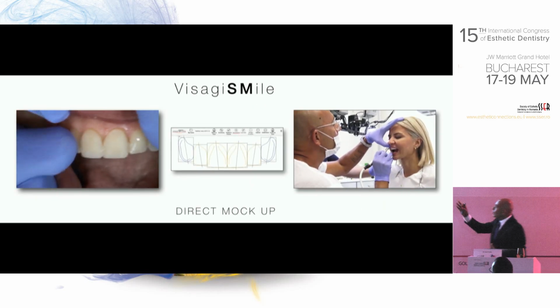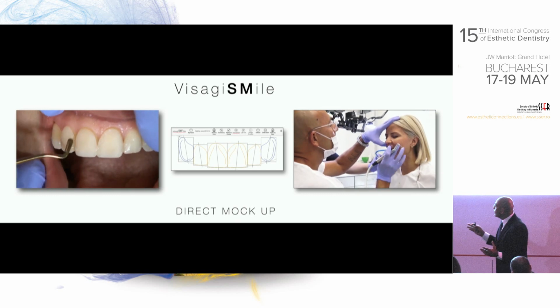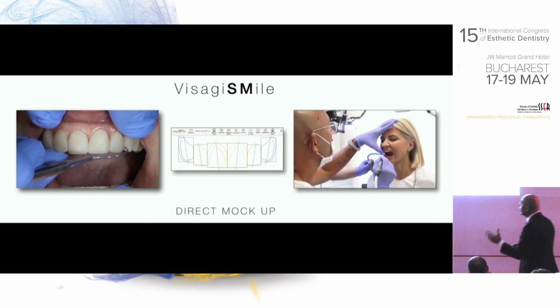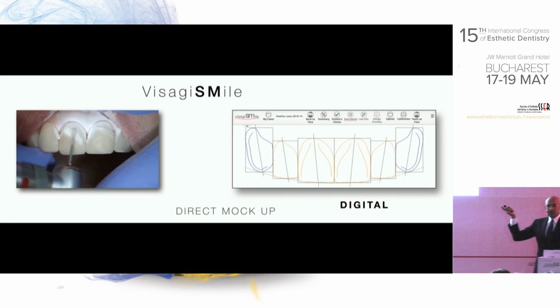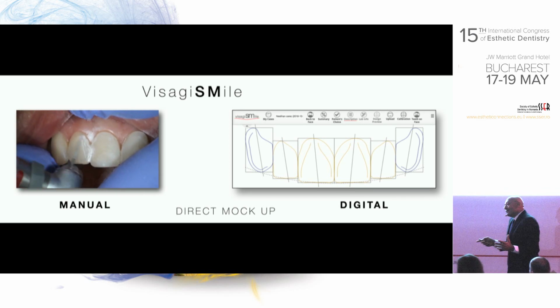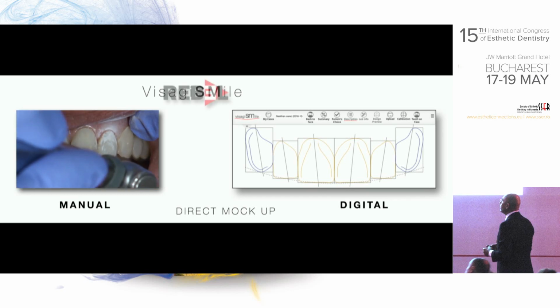Why? Because this was the way I would work. I loved it. But the problem is that when I started seeing my friends trying to use this from all over the world, even though this design was digital, we didn't have to think about anything, still the mock-up was manual. And not everybody is that comfortable using this kind of a direct mock-up.